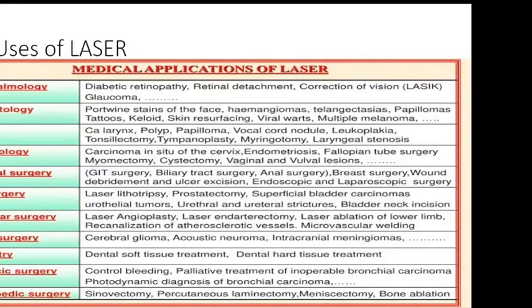So where do we use laser in our practice? It can be used in ophthalmology for anything that can be excised using laser, because it's a small organ and they might be working in small spaces and they need precision not to damage the adjacent structures.